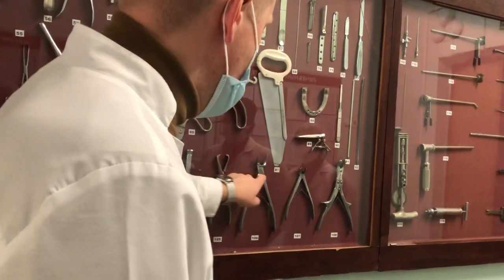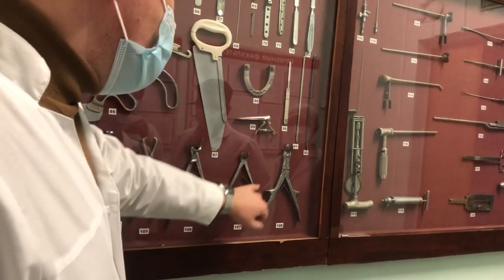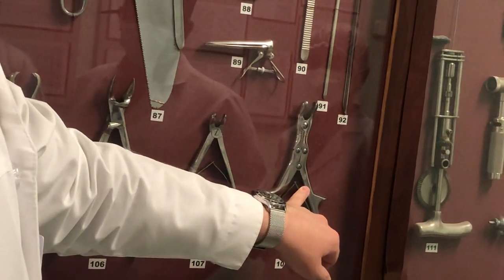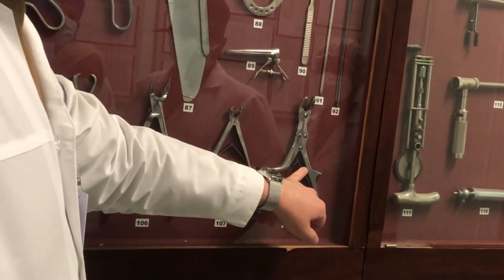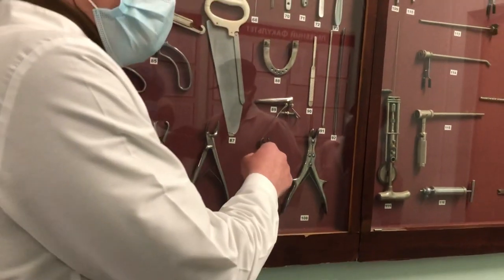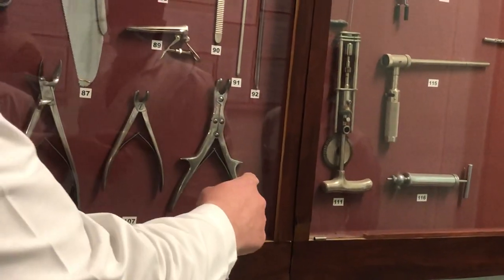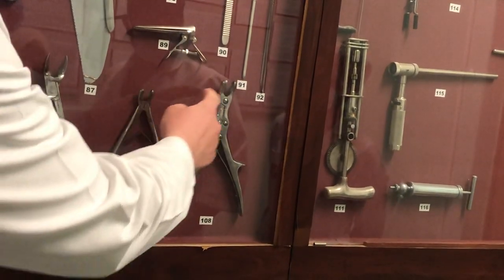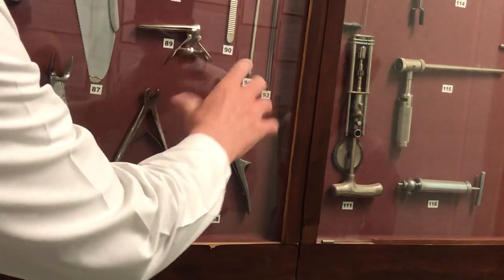Next, there are instruments for bones — this, this, and this are for next semester. But this instrument here is named Luer forceps. We studied Luer forceps during the operation on the scalp — for decompressive trepanation. Some students believe that if it's small it's for a child and the larger one is for an adult — no. You can see the difference in structure: here double gear, here single gear. That's why crushing of the bone is much easier with these instruments — it's decreased pressure.